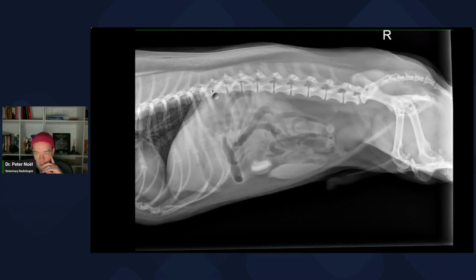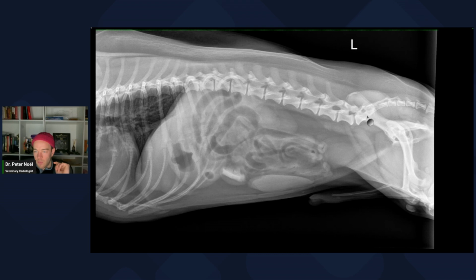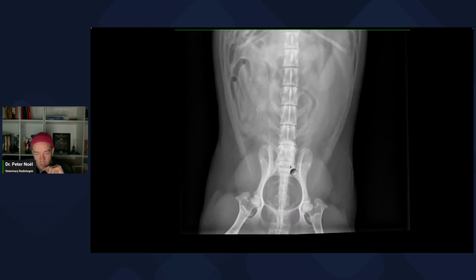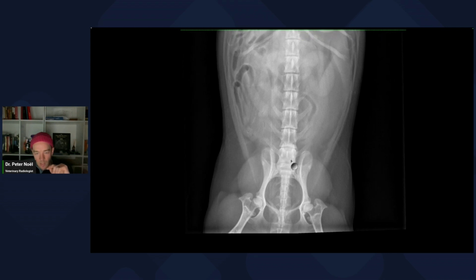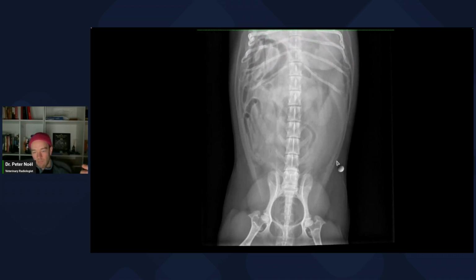And then this is a great case of a transitional lumbosacral vertebra. So you'll notice that this looks like the sacrum is super long. And if you look closely, there's a little physeal remnant. Not a physeal remnant, the junction between this lumbar vertebra and the sacrum, right? The sacrum should only be this length. So this is a transitional lumbosacral vertebra. And there's a faint transverse process.